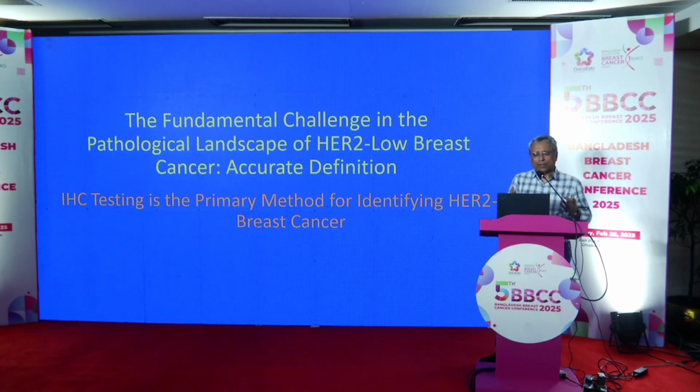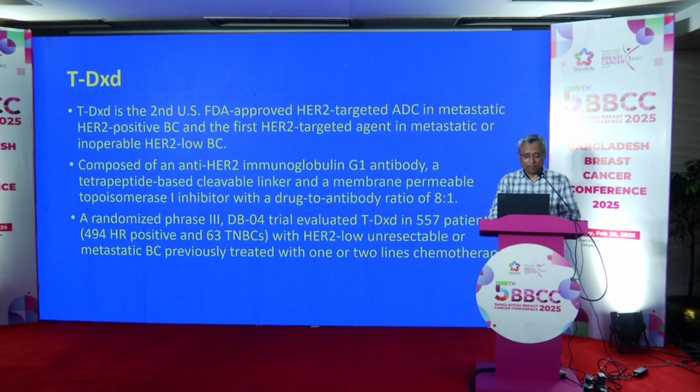I can tell you that it's quite interesting when you use AI to interpret this type of low expression antibodies. It's very helpful. You can identify very faint staining, which is important for HER2. So that is something we have been doing quite a lot recently.